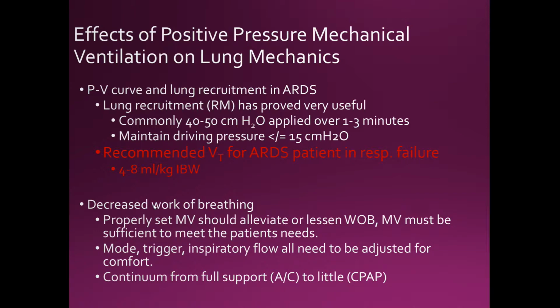So at negative 1 and negative 2 from baseline. If I'm at plus 5, I will set my trigger at plus 4 or plus 3. Therefore, when it hits one of those pressures, the machine will deliver the breath.